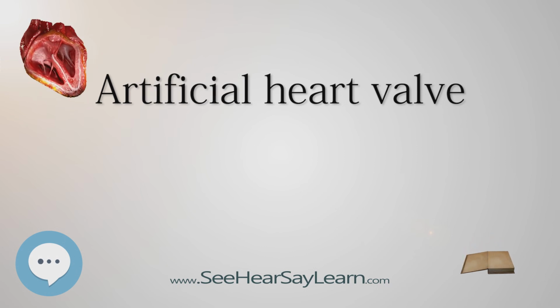Valves are integral to the normal physiological functioning of the human heart. Natural heart valves are evolved to forms that perform the functional requirement of inducing unidirectional blood flow through the valve structure from one chamber of the heart to another. Natural heart valves become dysfunctional for a variety of pathological causes. Some pathologies may require complete surgical replacement of the natural heart valve with a heart valve prosthesis.